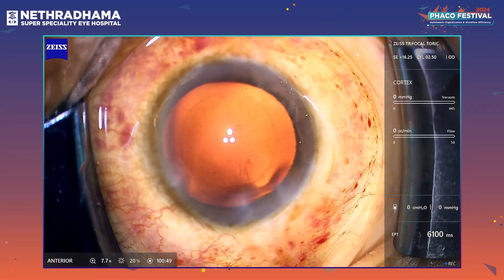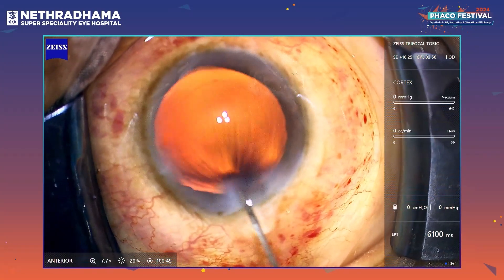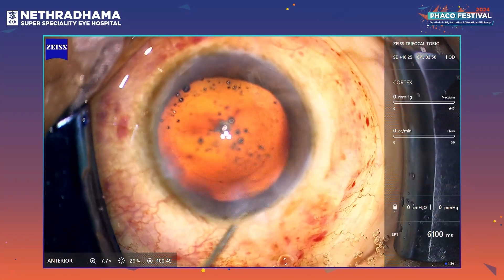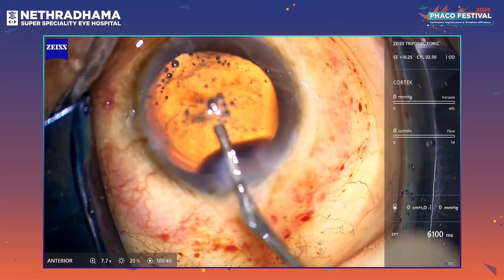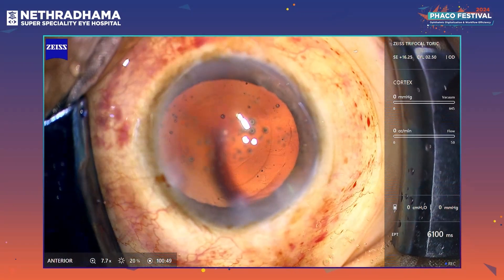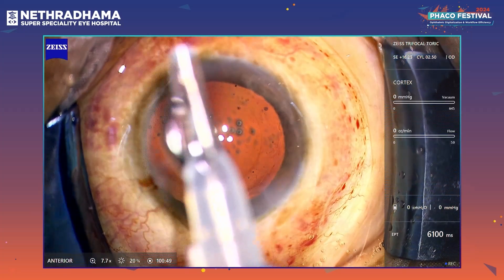There are some small fibers there. I am just doing a hydro polish and removing those small fibers — we have a nice clean canvas for the IOL implantation. Just using plain HPMC 2% to fill the bag before injecting the lens. This is a preloaded lens — it comes in the Bluemix injector.